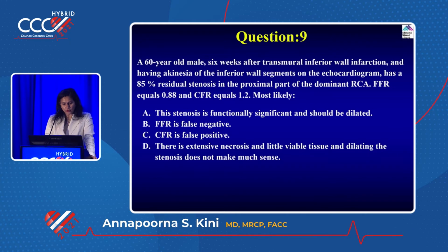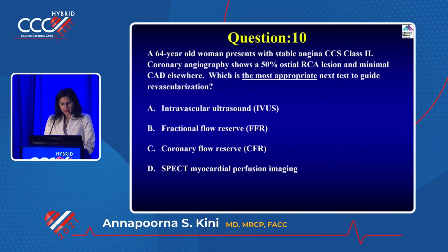So what are we supposed to do? Is the stenosis functionally significant? Which could be the right answer, C or D? Because it's falsely positive because of microvascular plugging.